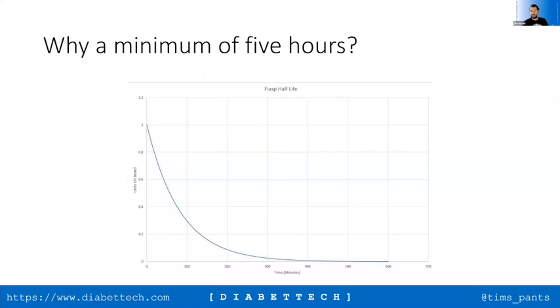So if you think about it, if you've done a large bolus, so instead of using 1 unit, let's say that's a 10-unit bolus, down at this level at 2 hours, there's roughly 2 units on board. Coming up to 4 hours, there's still a unit on board there. And that has an impact when you're doing things like exercise, etc. So this is why understanding DIA, or the algorithm understanding DIA, is important in how it works.